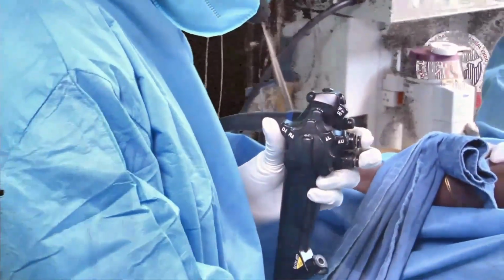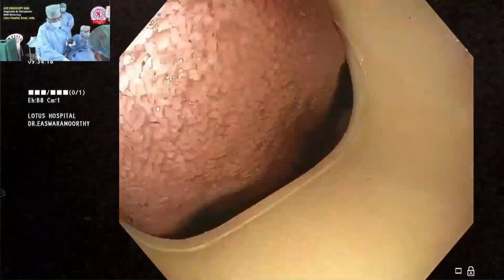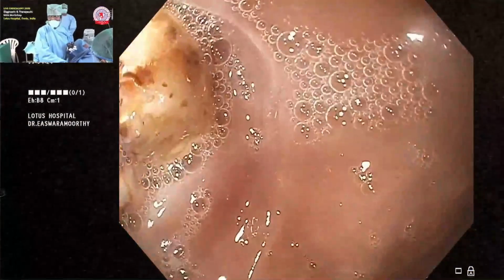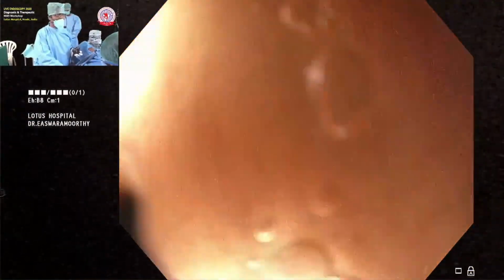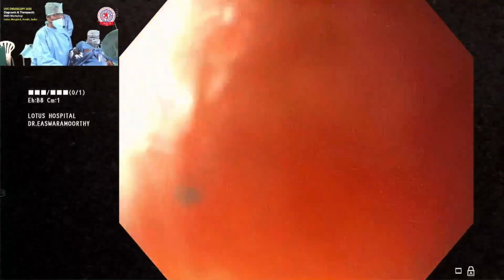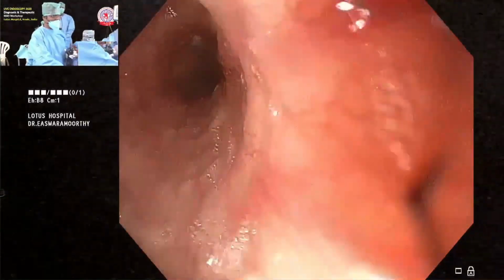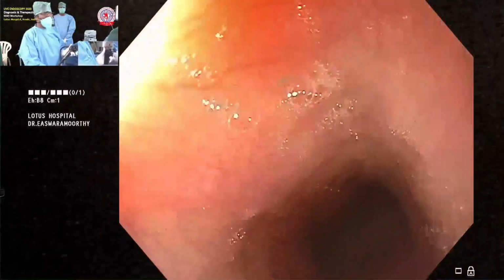Now I am going to place it just over. The first is a surprise finding of having the upside down view, because of the configuration. Okay. So as you go in, I'll go into the postcricoid region. As I said, this is an anxious patient, and I want to spend the shortest time, so I'm not going to dwell on what we have already done before.